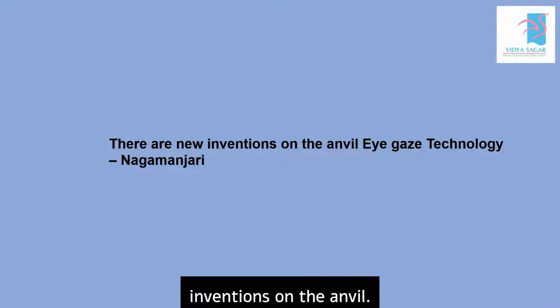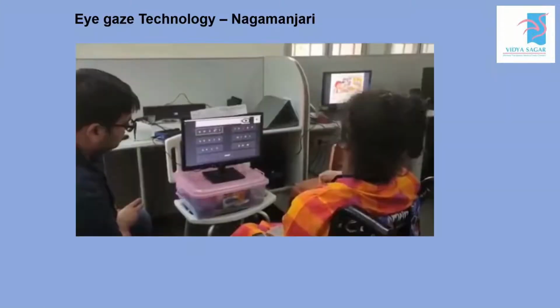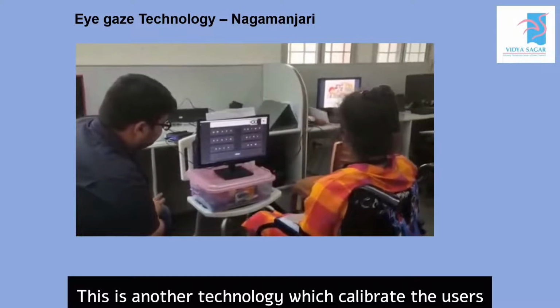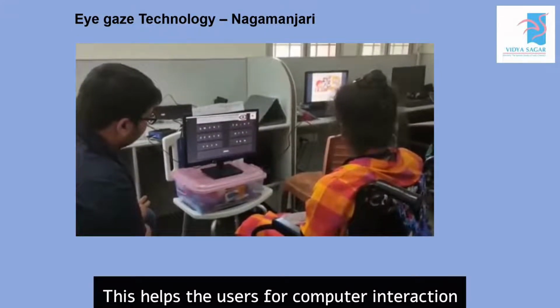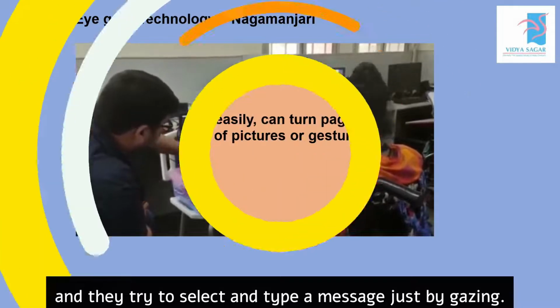New inventions on the anvil. I'm learning to use eye gaze technology. Eye gaze technology. This is another technology which calibrates the user's eyeball movement through an eye tracker. This helps the users for computer interaction, and they try to select and type a message just by gazing.